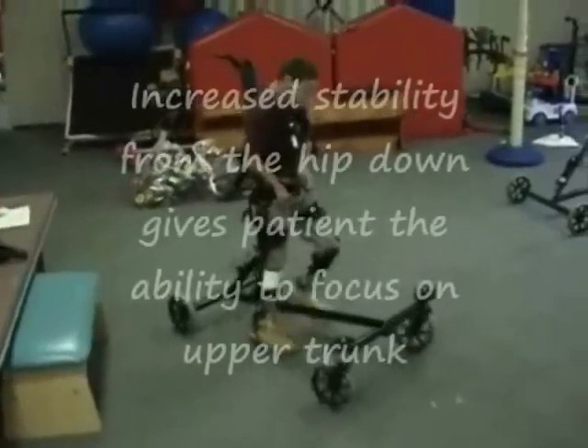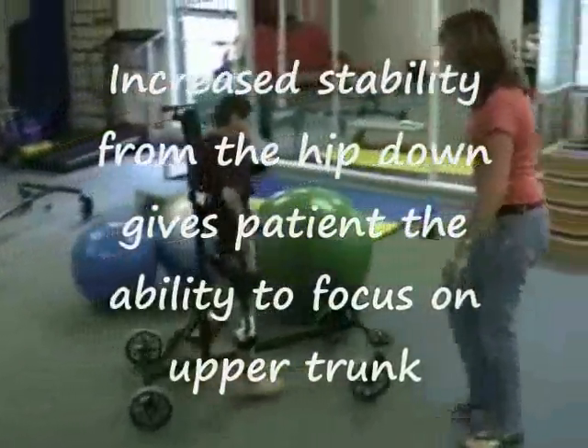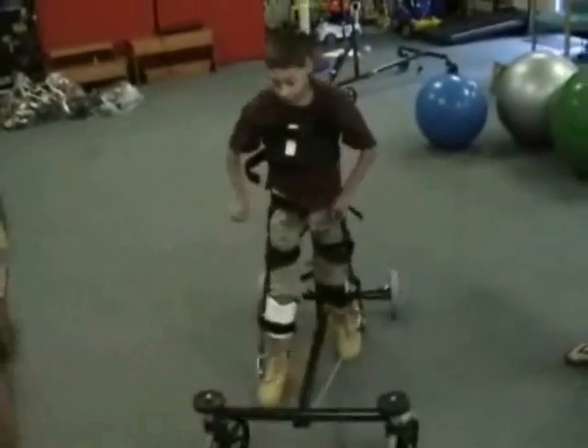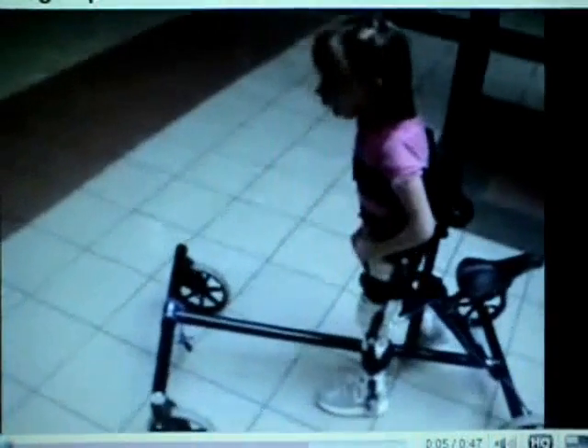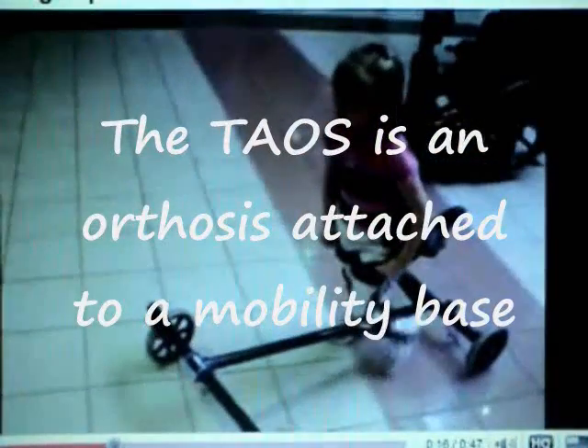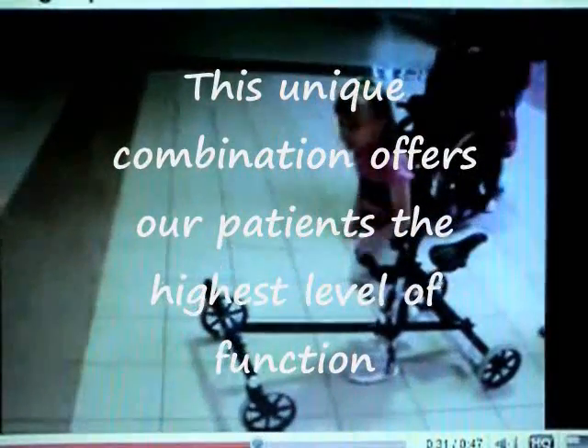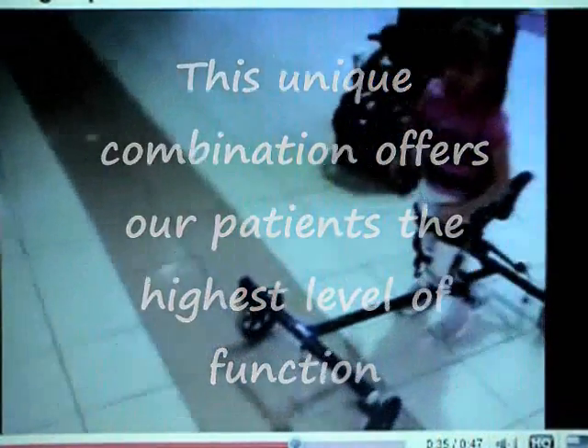The great thing about a TAOS is it encourages the patient to use it not just for physical therapy but for everyday activities. The increased stability from the hip down gives the patient the ability to focus on the upper trunk and play with their siblings — here he's just going after his brother. It can be used almost anywhere. Here we have a patient with the reciprocating gait cables on and they're in the mall. Basically the TAOS is an HKAFO orthosis attached to a mobility base — they can be used separately and some therapists use it to keep alignment and stability while sitting or doing other activities.